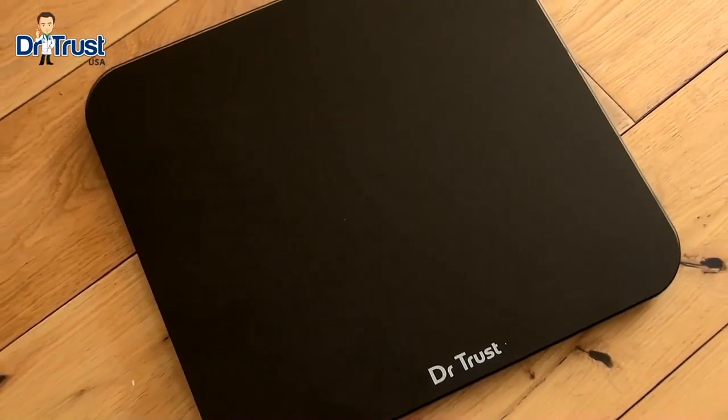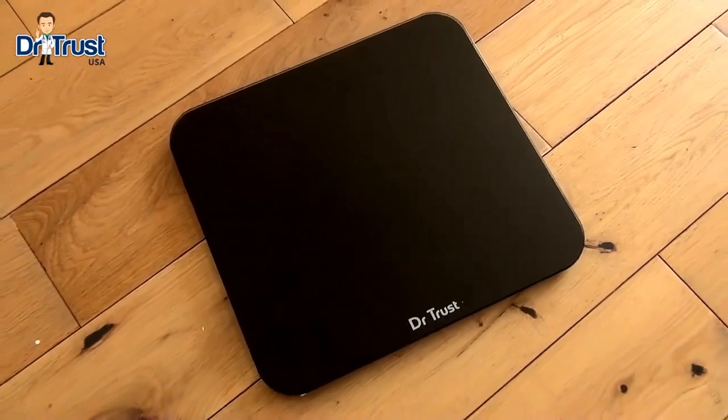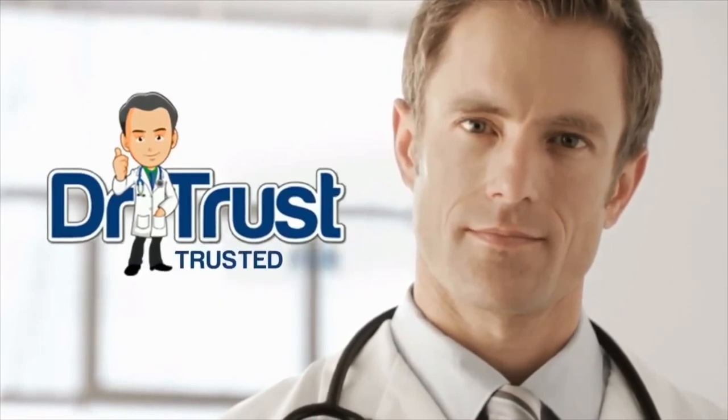Keep track of your weight the Eco-Way with the Dr. Trust Zeus Eco Recharge Personal Scale. Dr. Trust — Trusted for life.